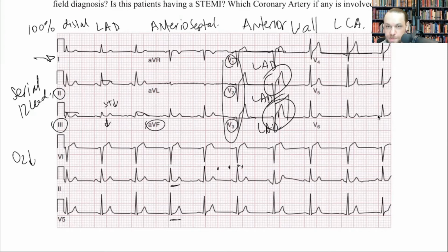What you don't want to do is this. Guy is having chest pain. You come in, you do a 12 lead. There's no ST segment elevation. You say, okay, he doesn't need to go to the cath lab. You disconnect the monitor, you take him off, right? Let's say you just give him aspirin, you bring him to a non-cath lab capable facility. You didn't bother to do a second EKG.